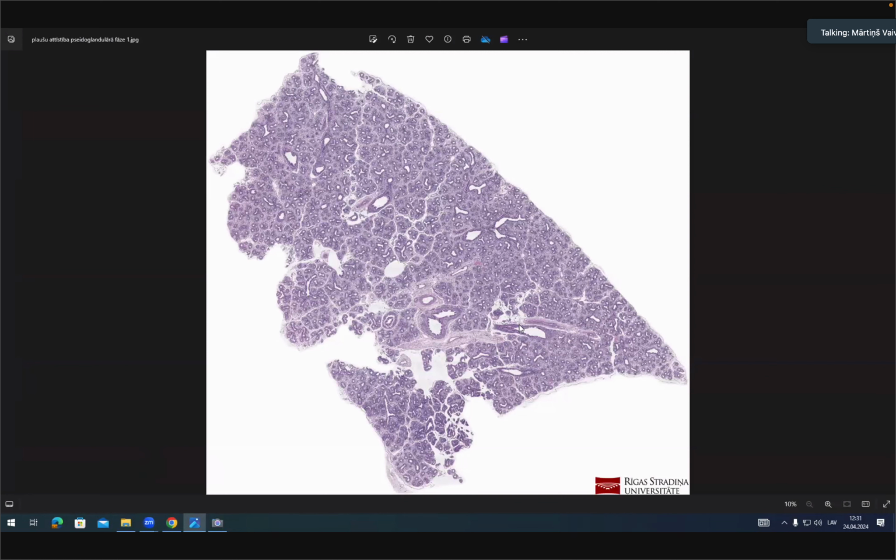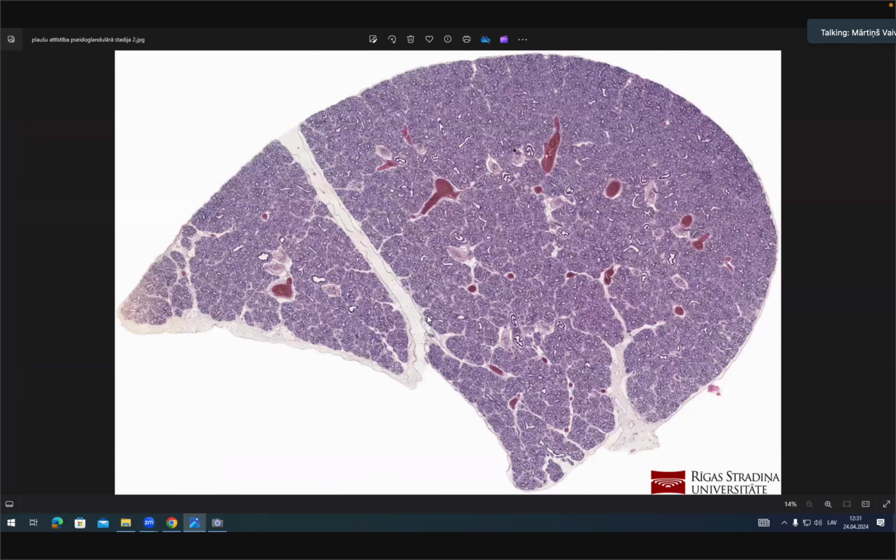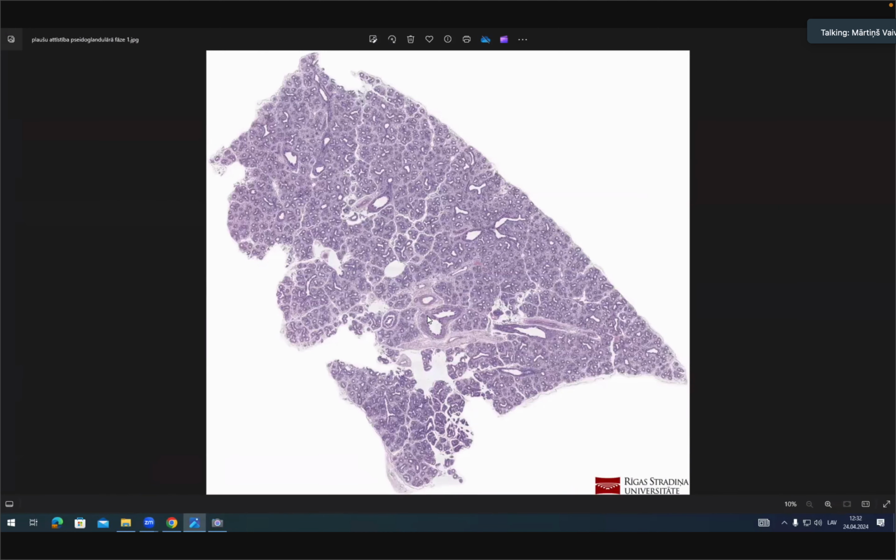So, first of all, there's different slide variations. Some slides are a bit brighter in coloration, so more pinkish coloration, more eosin is present. Others are a bit more darker, more basophilic. The darker slides belong to sheep. So sheep's lungs are a variation, and human slides are a bit brighter in color, but you do not need to differentiate the weeks for this slide. If you remember lung development pseudoglandular stage, it will be okay.